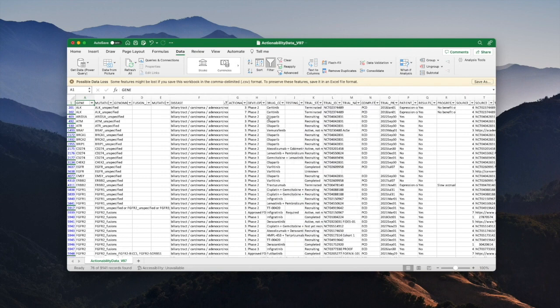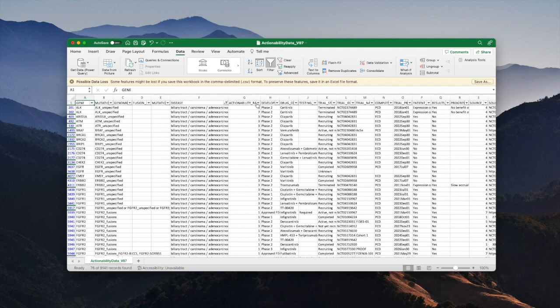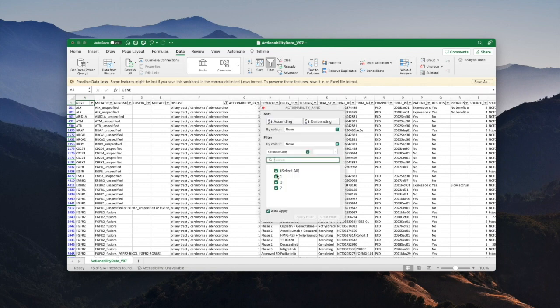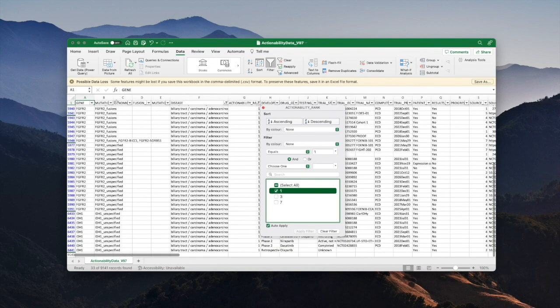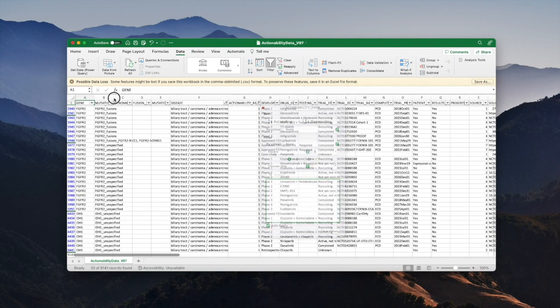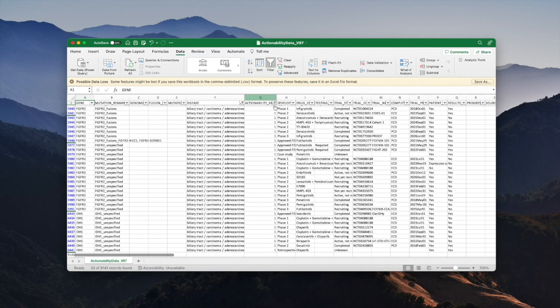If I would like to only see the things which have at least one FDA approved drug I can go to this actionability column and choose the actionability ranking of one. Now this list of mutations in the column called mutation remark, each of these has at least one drug that's been approved by the regulatory authorities and that was what led it to gain the actionability ranking of one.